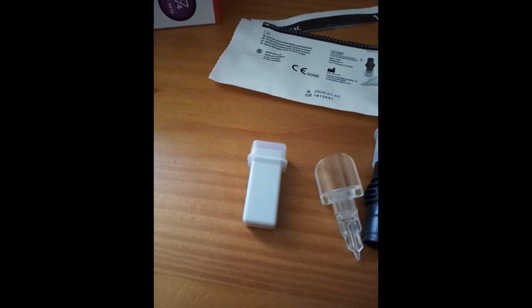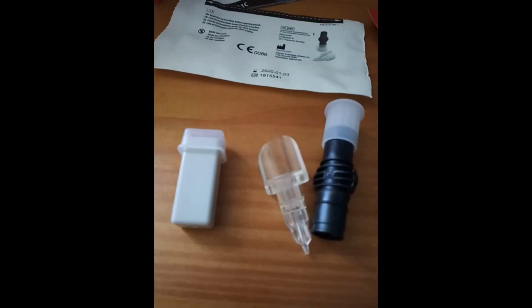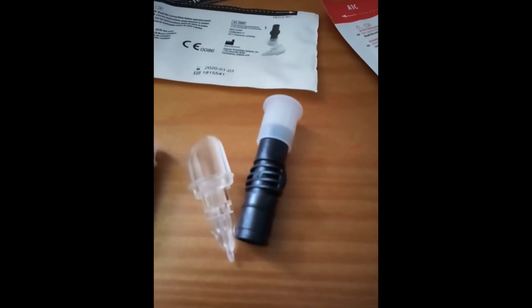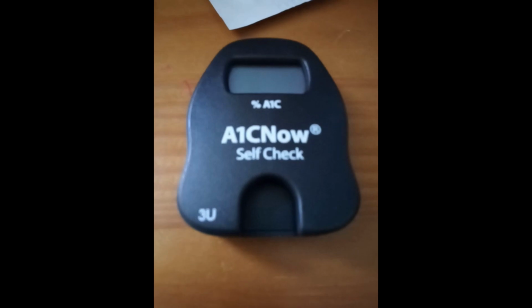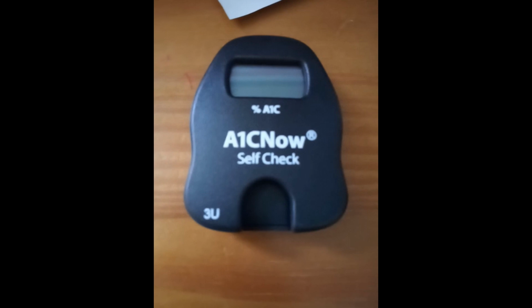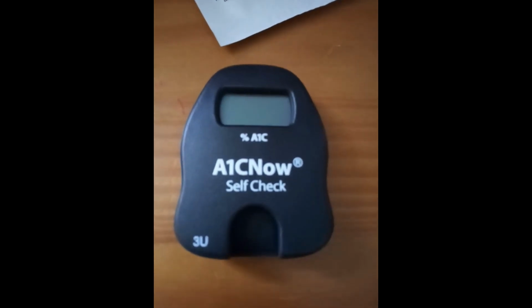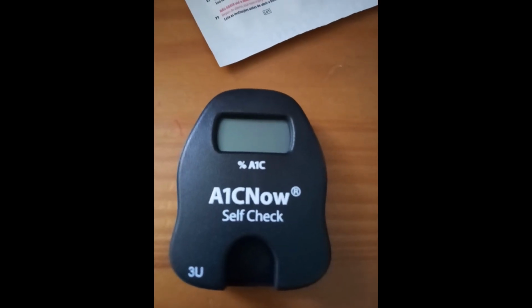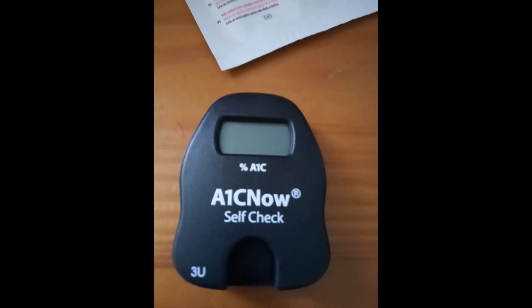That's the Lancet. And then effectively, prick finger with that, collect blood with that, insert that into that, shake it about 6 or 8 times, and then after you've taken the piece out of here, you insert it into there, checking that the 3U code there is the right code that's on this piece. After that, you plug it into the bit that's there, and you wait a bit. Luckily, because I purchased this from America, the A1C will come back as a percentage, which is great, because I don't understand any of these newfangled numbers. So, right, here we go.